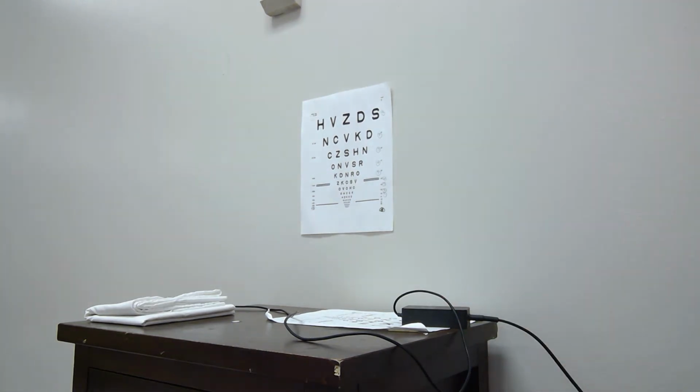For this test, Tina is going to be seated here, so we'll be over here together. What this test does is it compares the patient's visual acuity, so how clearly they can see when their head is still, compared to when their head is moving, which is a function of the VOR, maintaining gaze stabilization while your head's in motion. First I'll ask Tina to read the lowest line that she can.